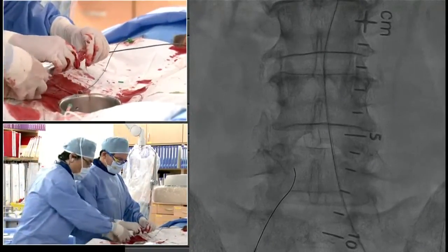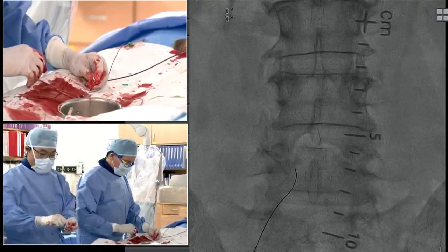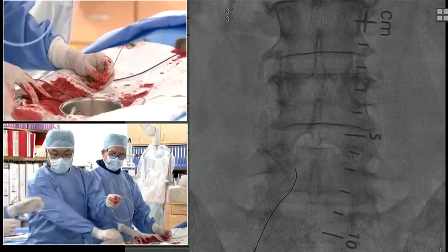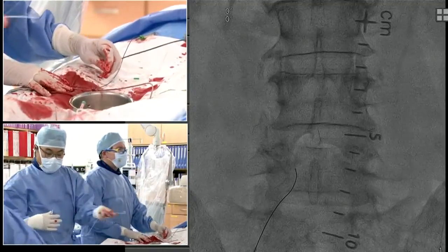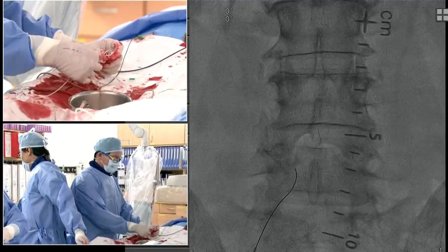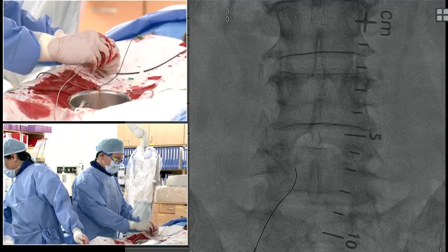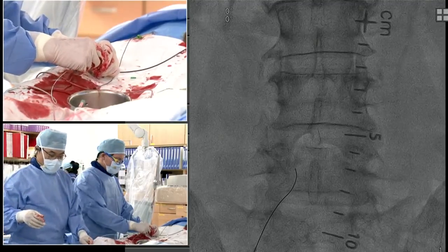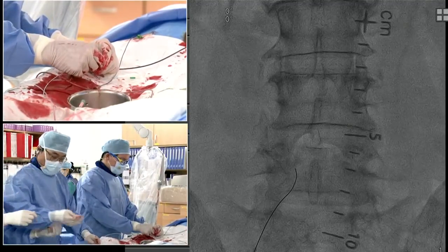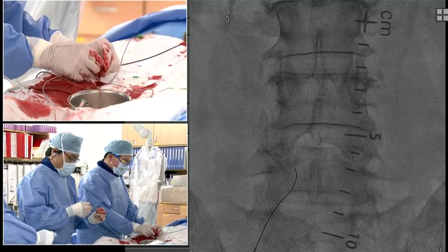You have a new Omni? And let's go up with that new Omni. You can get good support to cross. So you could use radial access and right femoral access. Dr. Hoijo? Yes, we have the long multipurpose 5 French, 150 or 180. So if you want a radial approach, you achieve the strong backup. So yeah, I think just the pushing wire maybe. Yeah, that's a good option too.